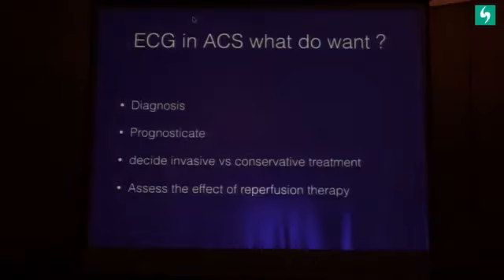So what do we want the ECG in acute coronary syndrome to tell us? It should diagnose, it should prognosticate. It should decide whether we want to go for an invasive strategy or a conservative strategy, and the effect of reperfusion therapy in such a patient.